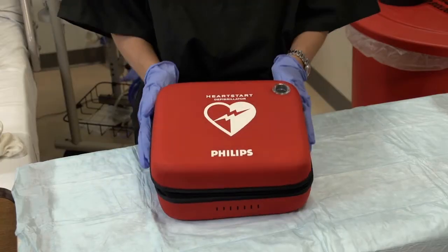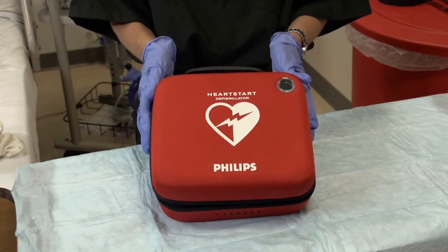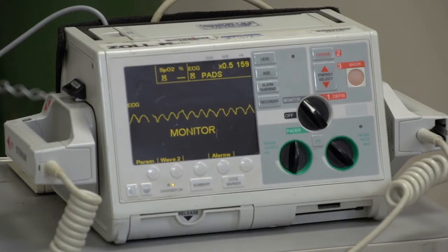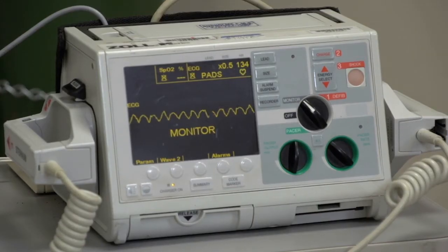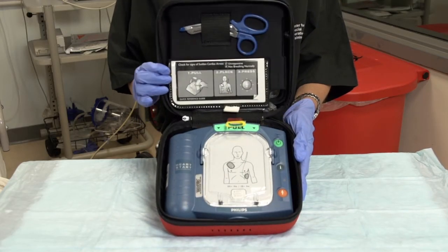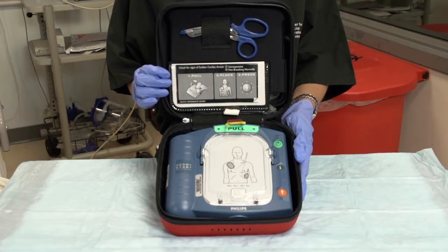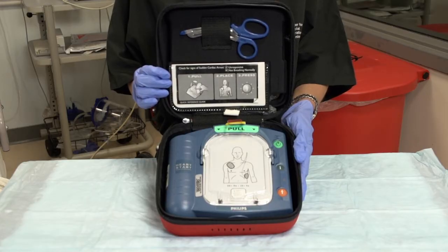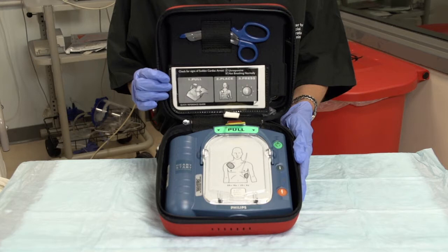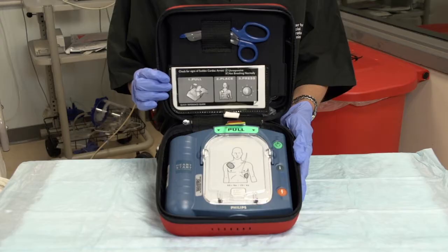There are two types of defibrillator: an automated external defibrillator, usually called an AED, and a manual cardioverter defibrillator machine. Automated external defibrillators recognize shockable rhythms and set current levels automatically. Some AEDs also defibrillate automatically, but others prompt you to defibrillate. AEDs have adhesive electrode pads attached, and the pads incorporate a conductive gel.